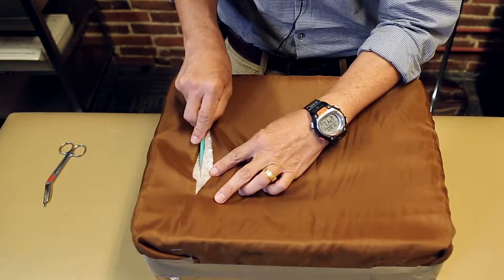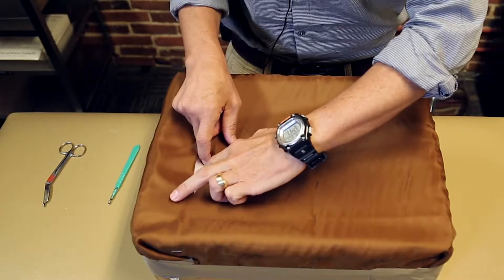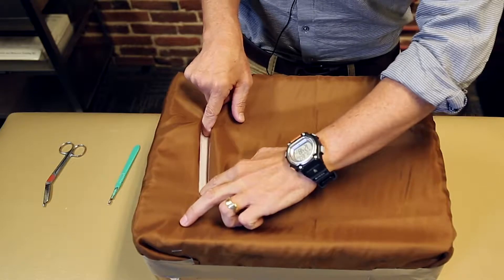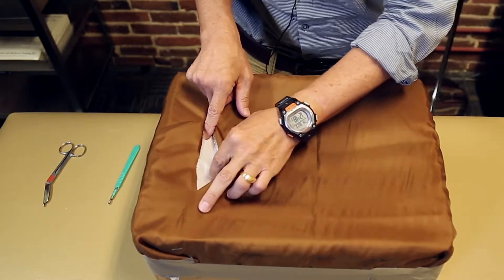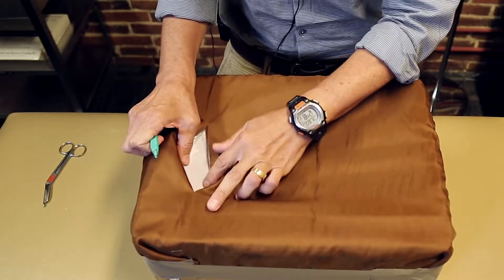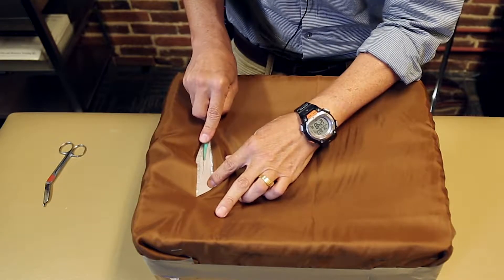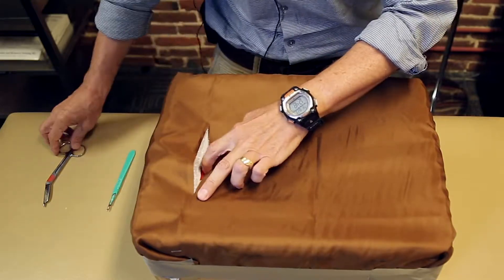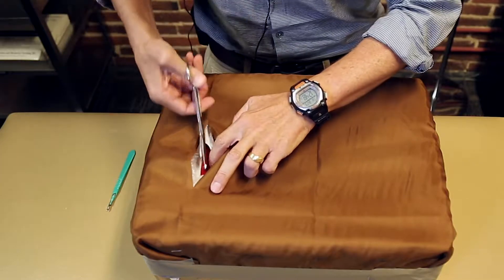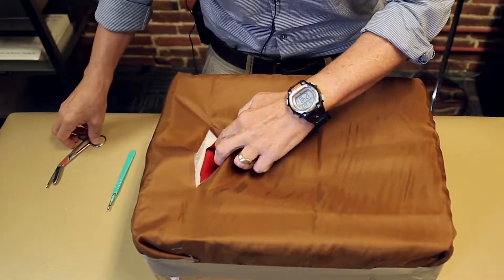For the subcutaneous layer, cut a little bit in the midline — about two to three centimeters — then bluntly extend that opening. Now we're at the level of the fascia, and you can see the white layer. Cut through the fascia, then bluntly extend it, or if it's tougher, use scissors to extend your fascia layer.